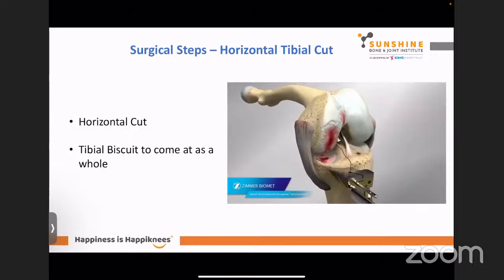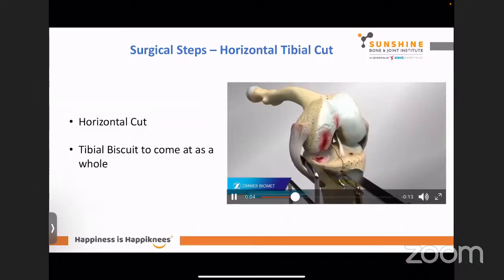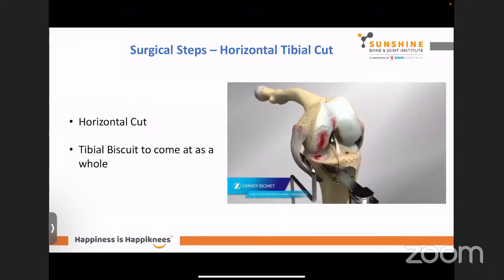Next is the horizontal tibial cut. The tibial biscuit should come out as a whole. So this is what happens. You put in an MCL retractor. Then you get your horizontal blade in, and you can go and take your horizontal cut of your biscuit.